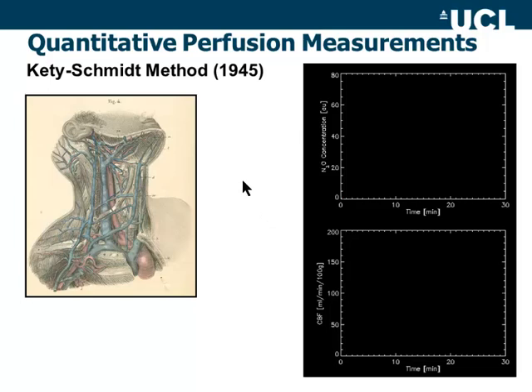Now the interesting thing is sometimes you see lactate over NAA, sometimes not. The question is, is this simply directly related to blood flow, whether you have high lactate or not? Effectively, I think to answer this question you need a perfusion measurement, and here I'm going to go a little bit into the presentation of ASL, which was just used by the previous speaker, so I'm just explaining what it is based on.